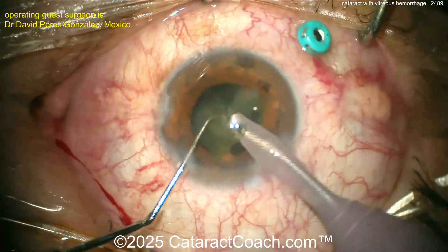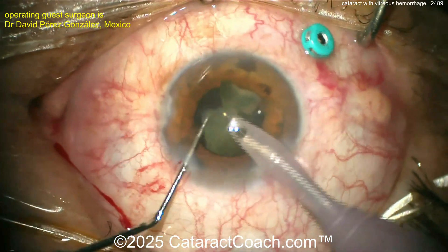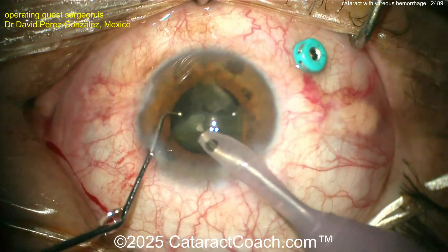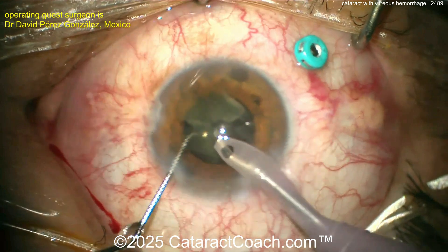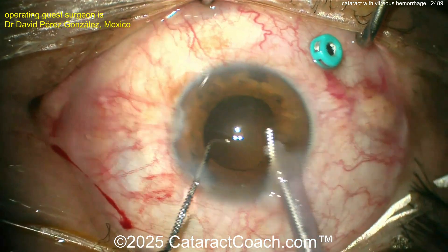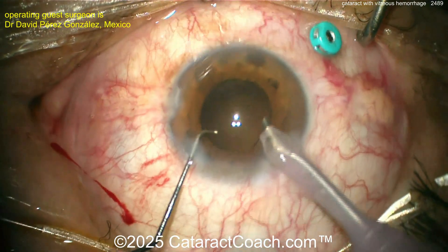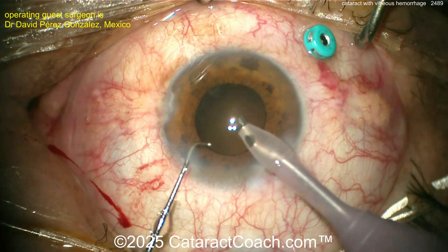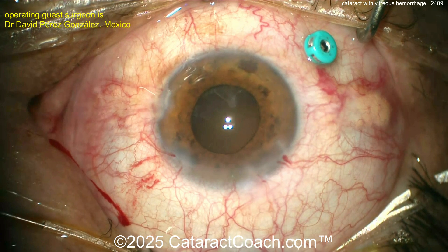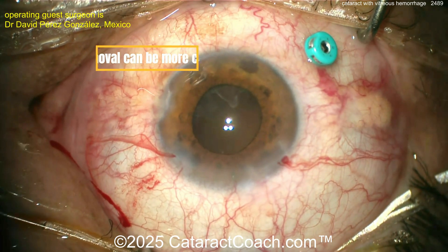This is common in patients with proliferative diabetic retinopathy or neovascular issues from retinal vascular occlusive disease. We're speeding up the nucleus removal — that's not the really interesting part. It's pretty straightforward: stay away from the capsular bag, bring pieces up to the iris plane, and emulsify them. In many countries outside the US, vitreoretinal surgeons do half cataract and half vitreoretinal surgery, though in the US the two fields tend to be more separated.